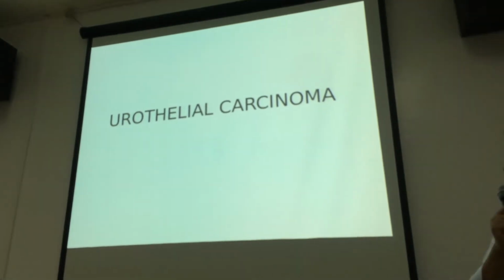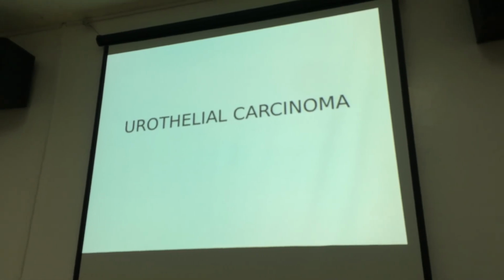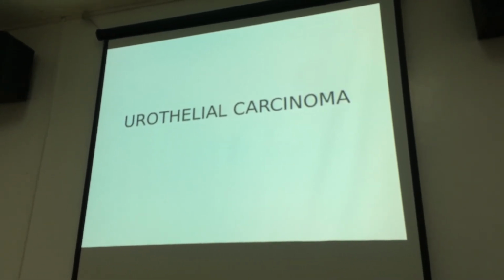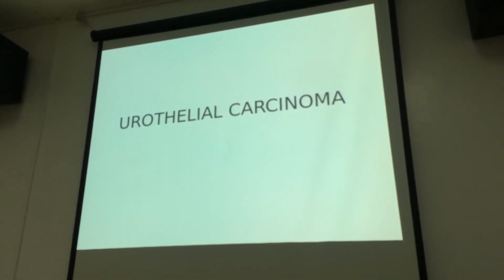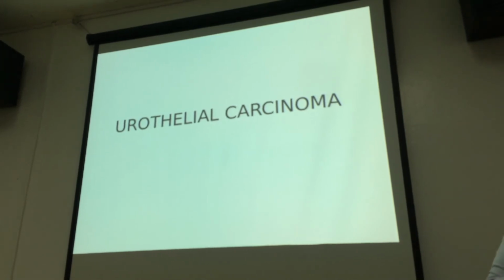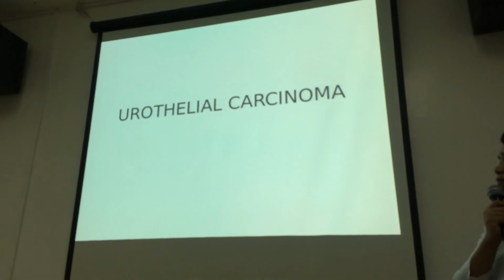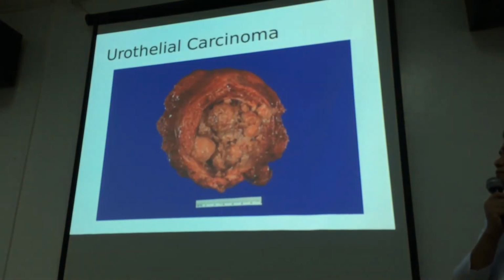Urothelial carcinoma. So this is the last pathology we're going to discuss. Urothelial carcinoma is a malignant neoplasm that grows within the urinary bladder. Now, there is a strong association between cigarette smoking and the incidence of urothelial carcinoma.